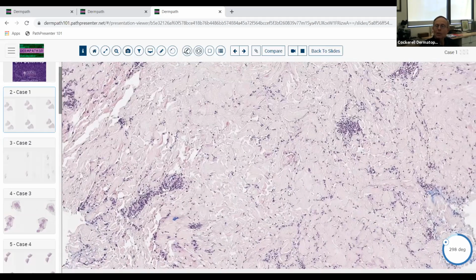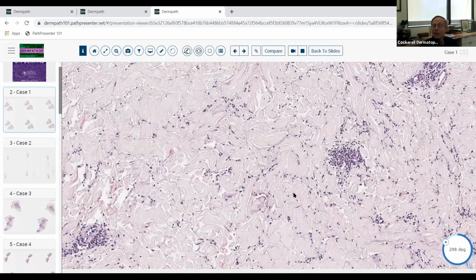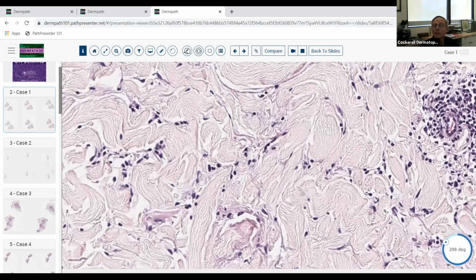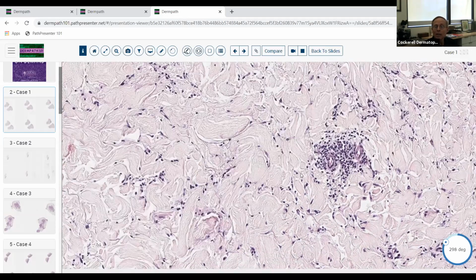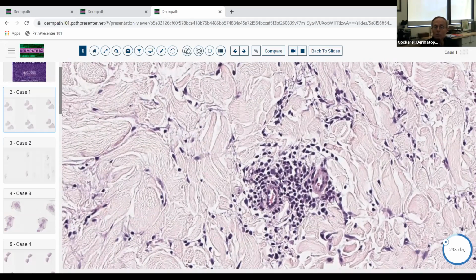And the fact that there's a significant interstitial component is a very important part of the differential diagnosis here. There are really not a lot of diseases that give mostly interstitial inflammatory patterns. And so just like we talked about in the introductory lecture, you want to ask yourself what kind of cells are in here. And here they happen to be lymphocytes and plasma cells, and also in some areas there may even be some eosinophils. These little aggregations here are lymphocytes and plasma cells, which is important.